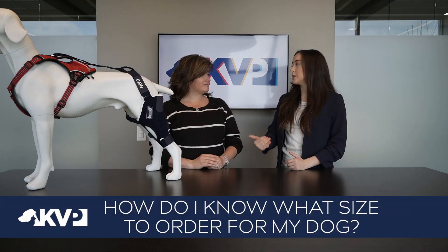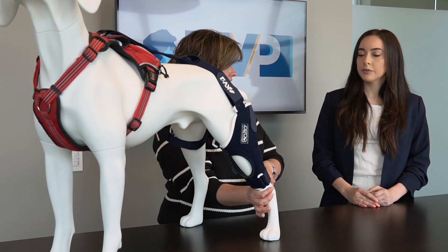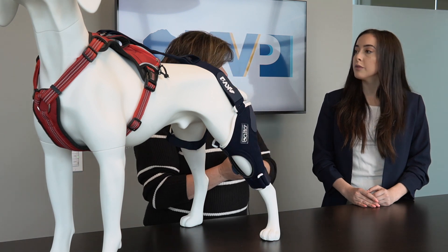So how do I know what size to order for my dog? There are three different measurements when you come to the jump brace. You want to measure the circumference around the top of the hock, the upper thigh — that gives you two of your measurements — and then the length of the leg. These three measurements are going to show if you need a small, medium, large, or otherwise. If you get measurements for three different sizes, go with the middle size. If you have measurements for two sizes, go with the smaller of the two.